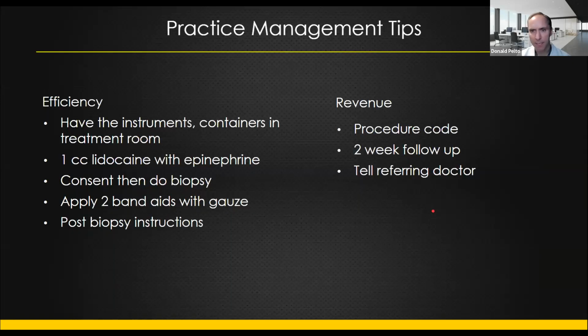Some practice management tips, because I do these quite a bit in the office, and I do them same day. I don't have patients come back. So you have to have the instruments in the treatment room. So I have 2 millimeter punches in every single treatment room, and little bags for nails, and little formaldehyde cups. Okay, I always ask, give me 1 cc of lido with epi, and my staff knows when I ask for that, they are going to prepare the consent for the biopsy. So they do that for me as well, and I tell them where it's at.